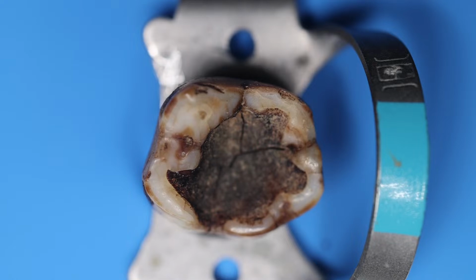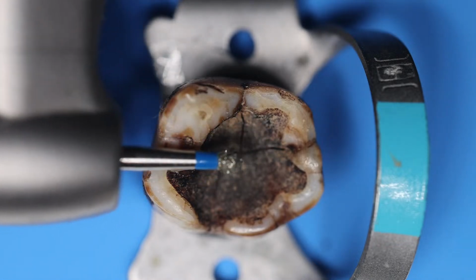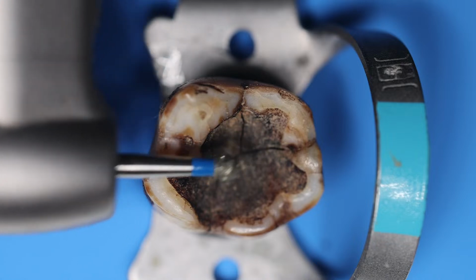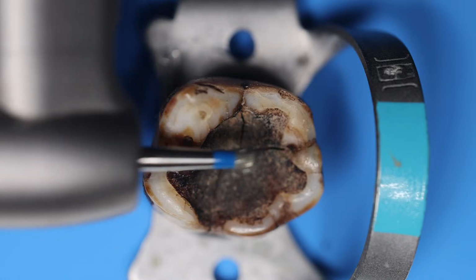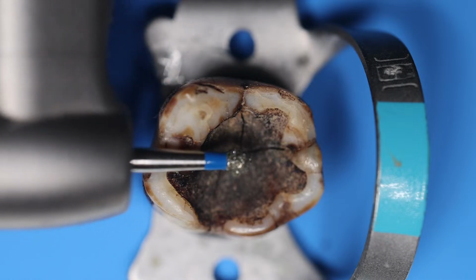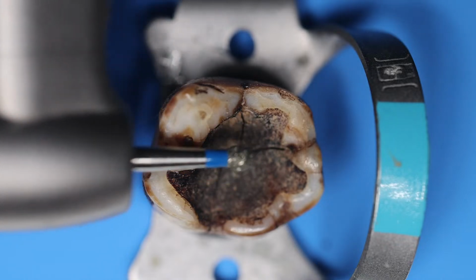The thing that we should always try to begin with is a round burr, and this should be a big round diamond burr. You may use a carbide burr, but initially when you progress for the access opening, because you are penetrating enamel, you need a diamond burr, so you can start with the round burr.